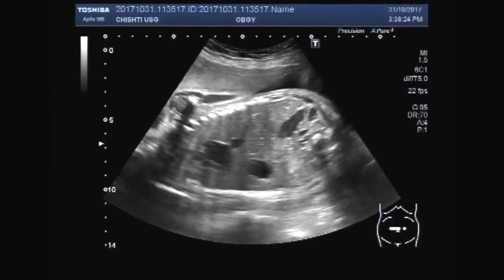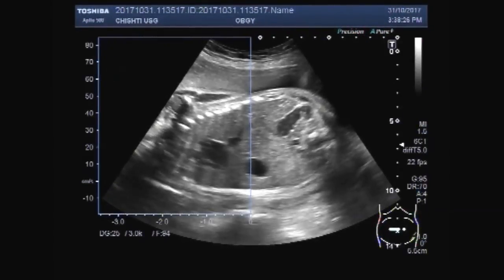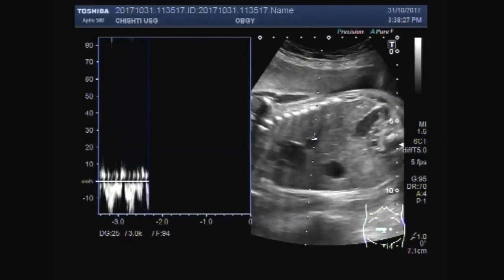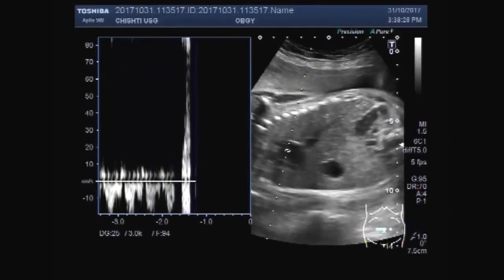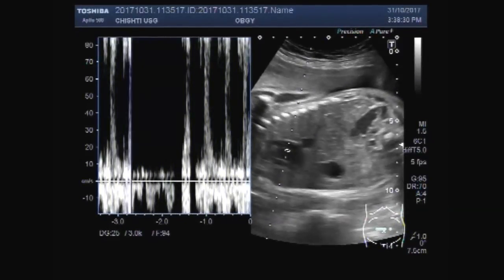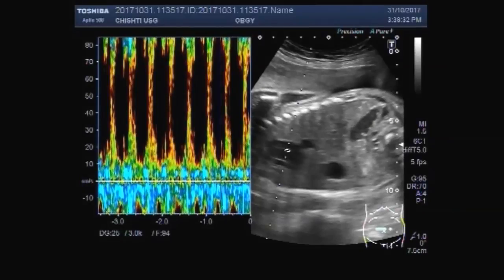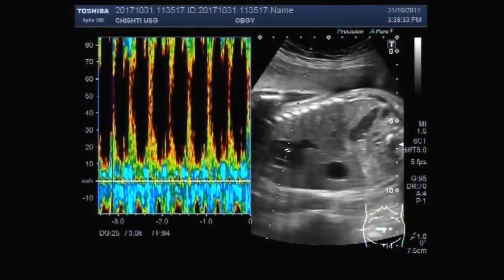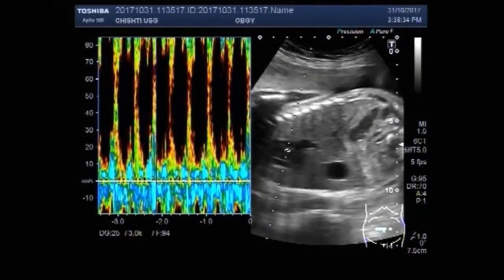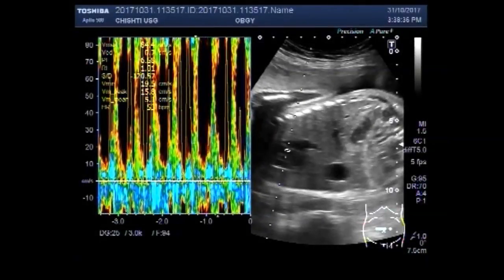The stomach bubble is also seen. Fetal cardiac activity is present.